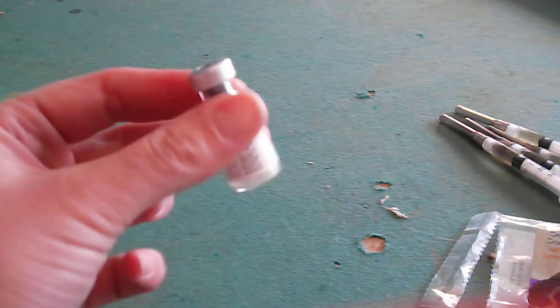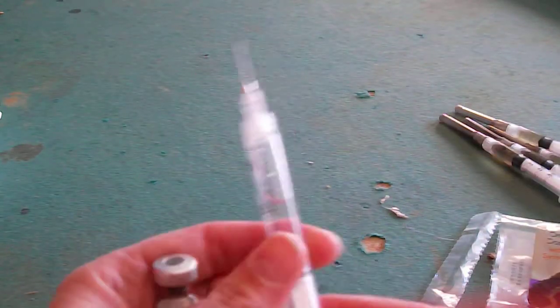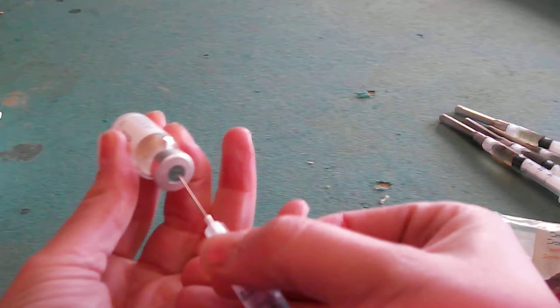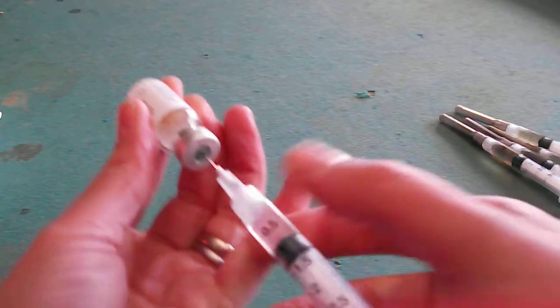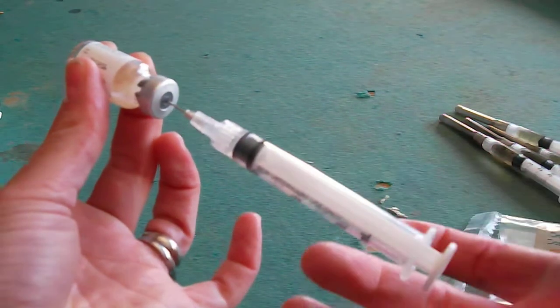This is the dry powder. Insert the needle. Push most of the air back out. Insert the needle in. It'll automatically squirt it in there.